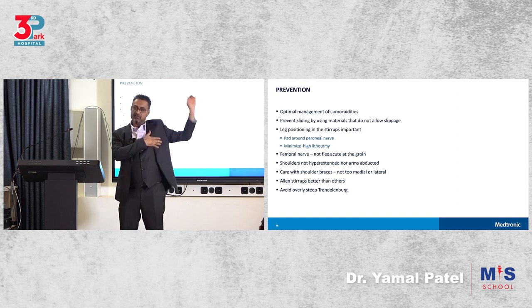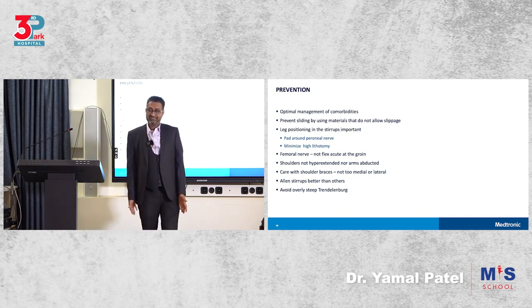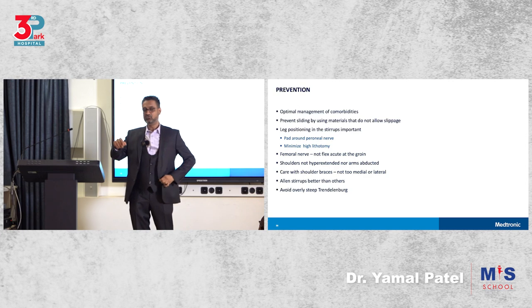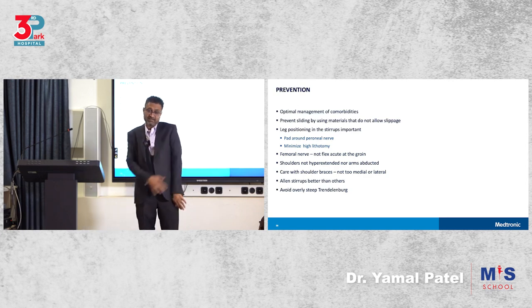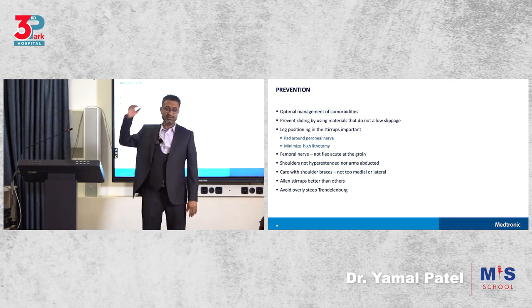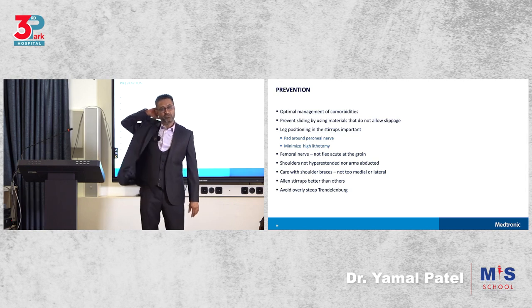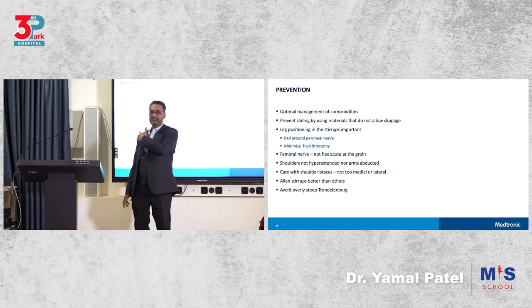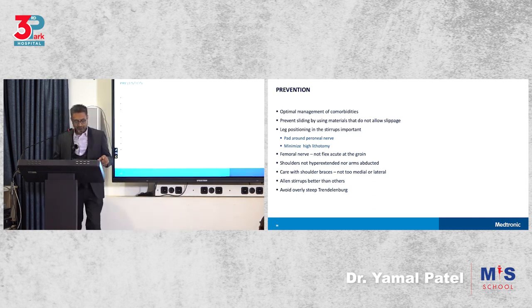Don't do that. They are supposed to position them on the side of the patient with an extension lining that you can then have on the side, and they're tucked in. You've understood? Or if you want, then this might be okay, but you can't go above that angle. You'll injure this place. Then Allen stirrups, and avoid a very steep Trendelenburg, especially if you don't have anti-slip mechanisms in place.